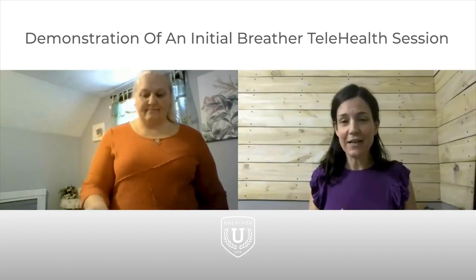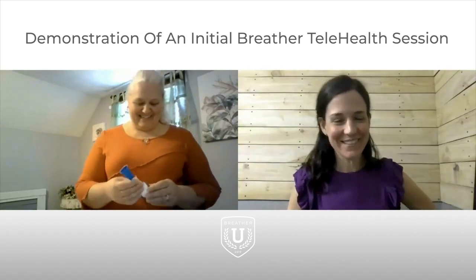How are you feeling now? You feel like you can do another set of 10? I can try. Okay, I'm actually going to count this time. All right, keep it at 1 and 2, correct? Yes, so 2 for inhale is your resistance and 1 for exhale.